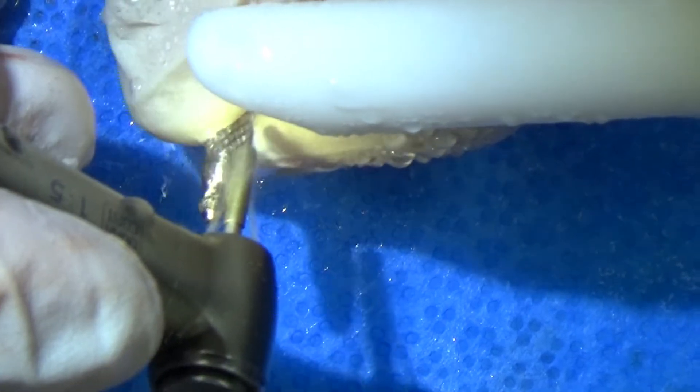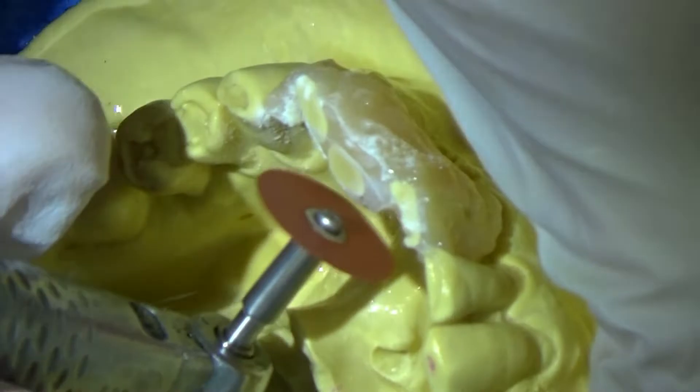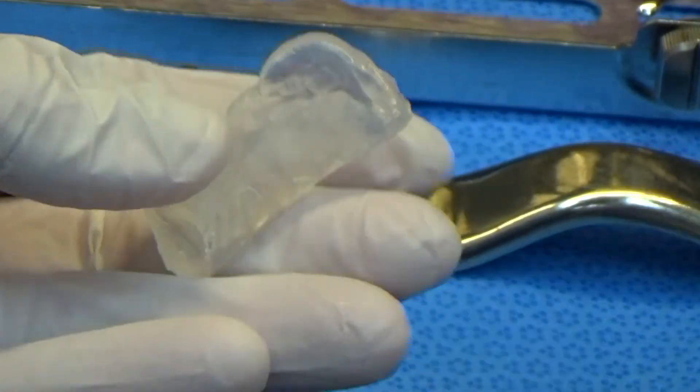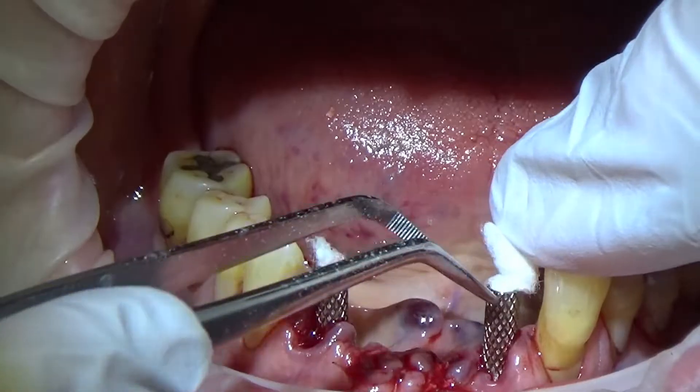I've used a diamond and a disc to remove the emergence profile so that it actually just stays the same size as the implant, then screw that into position. We'll use the model we made from the alginate impression, putting a little bit of cotton in there to stop the Visacryl going down the inside of these cylinders.